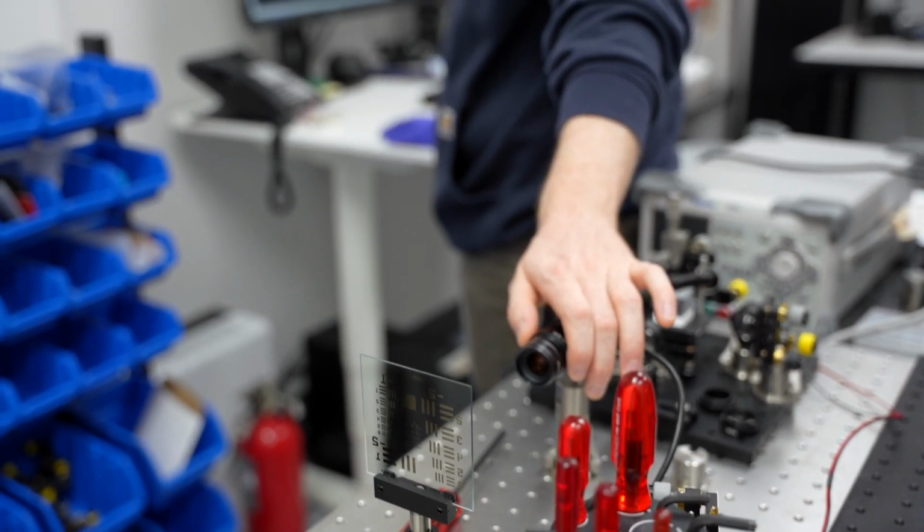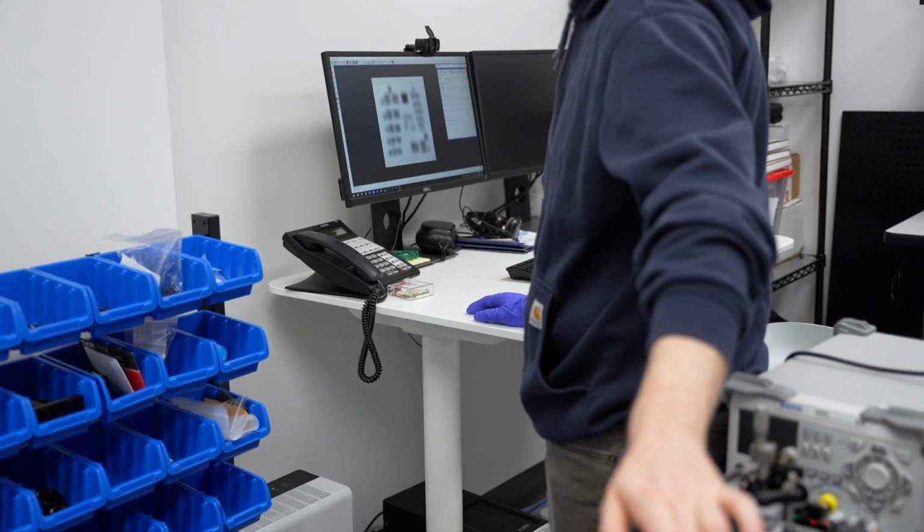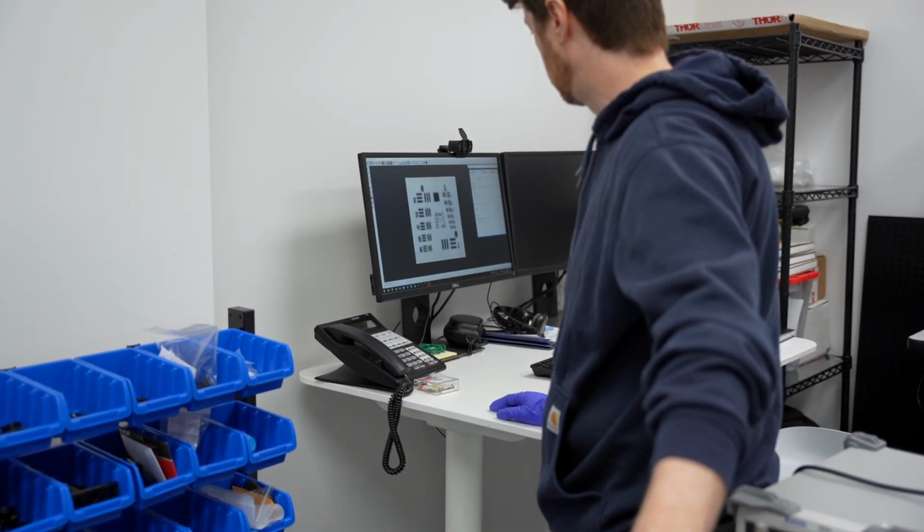When we're thinking about resolution, we have to basically pick a camera resolution that's going to enable us to have all the relevant details and the image be clear. And we also have to consider the specifics of how the image is going to be displayed to the end user. So for example, there's not a lot of point in taking a super high resolution 8K image if ultimately that's just going to be displayed on a 3-inch 640 by 480 pixel display.